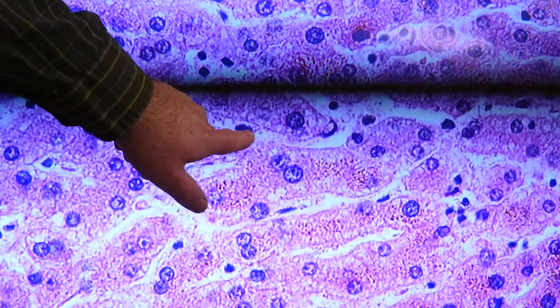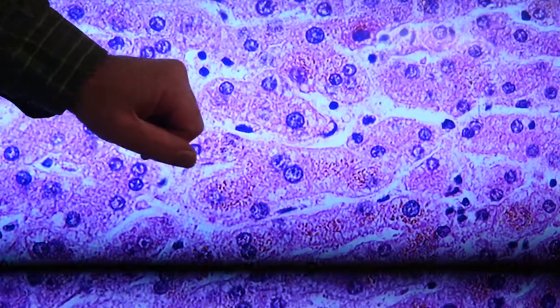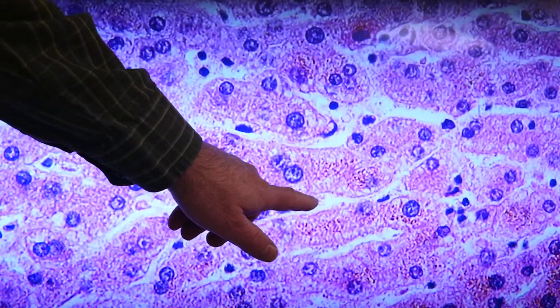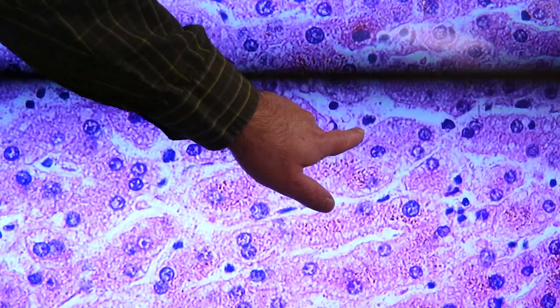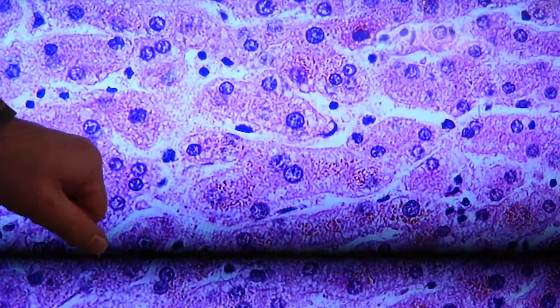This would be an endothelial nucleus. They're generally more flattened. Here's another down here. It's a little bit hard to see in this one, that space of Disse between the endothelial cell and the hepatocyte. We see a little bit of it right here in this example. There are some Kupffer cells. Here's a Kupffer cell bulging out into the sinusoid space right here.